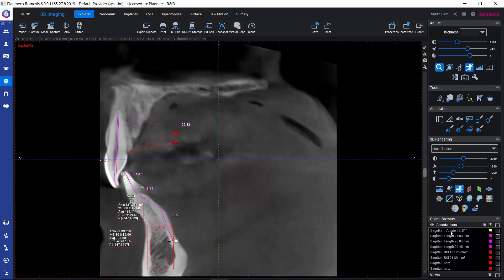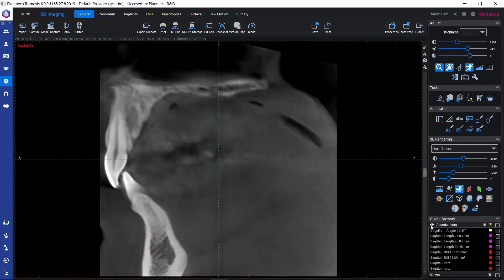It works as a sort of link. We can also temporarily hide annotations using the eye icon. For example, in the annotations group there is an eye icon with which we can hide all the annotations at once.